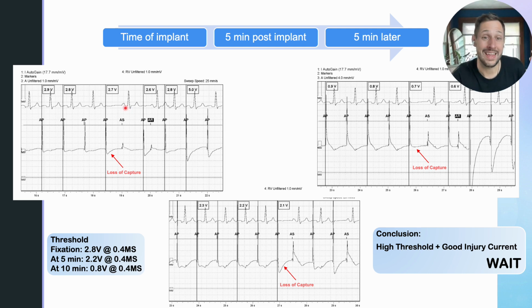One thing to note, the EKG of the atrial looks very different from the intrinsic than the pacing. Why? Because we're pacing from a different part of the tissue, right? We're pacing not from the sinus node, but from a different aspect. It just causes a different depolarization, which causes it to look different on the EKG. But things to recognize here, I'm using all my context clues. We have intrinsic breakthrough, we have conduction, and it all corresponds to me decrementing my output. Pretty cut and dry.